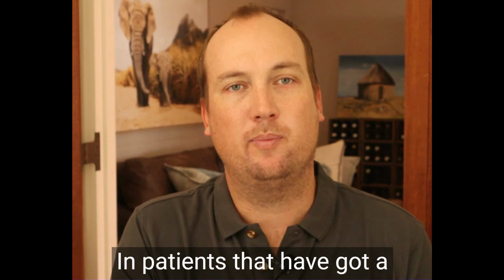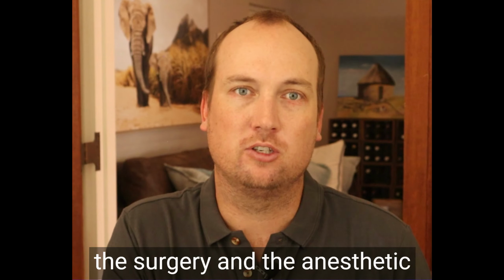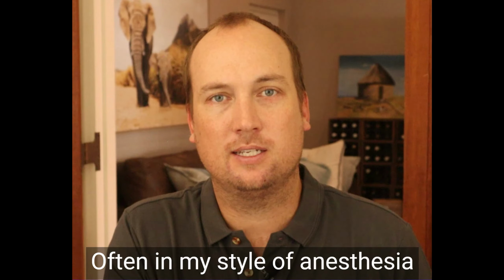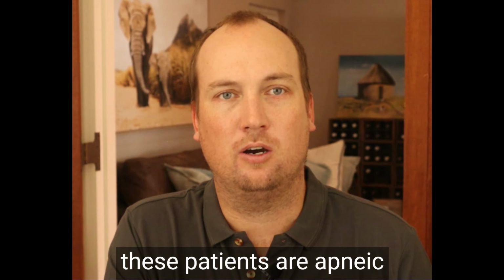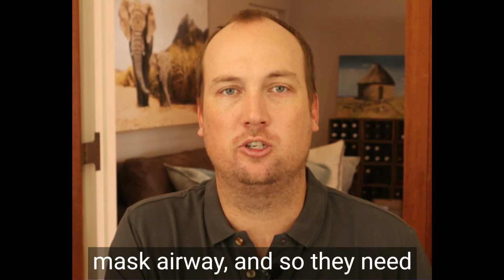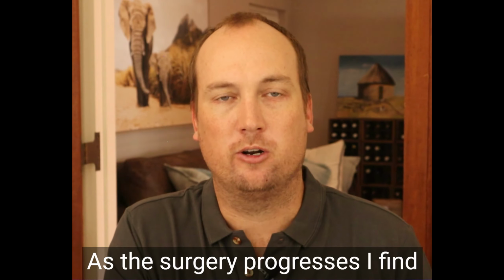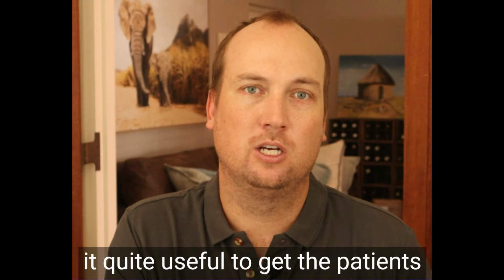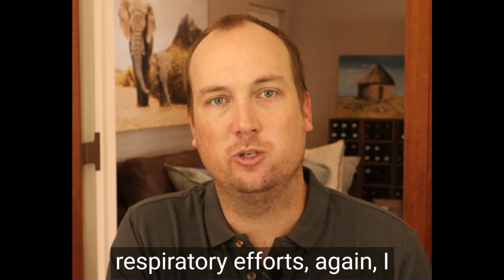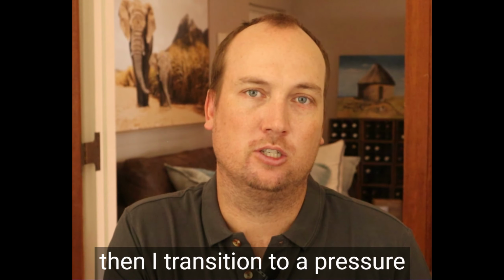In patients that have got a supraglottic airway, my ventilatory mode depends on the nature of the surgery and the anesthetic that the patients have received. Often in my style of anesthesia, these patients are apneic post-insertion of the laryngeal mask airway, and so they need volume-controlled ventilation. As the surgery progresses, I find it quite useful to get the patients to breathe spontaneously, and so when I see signs of respiratory effort again, I start with an SIMV mode, and then I transition to a pressure support ventilatory mode.